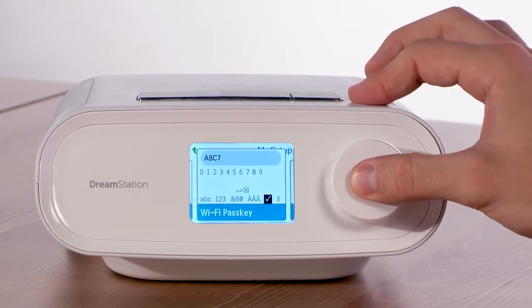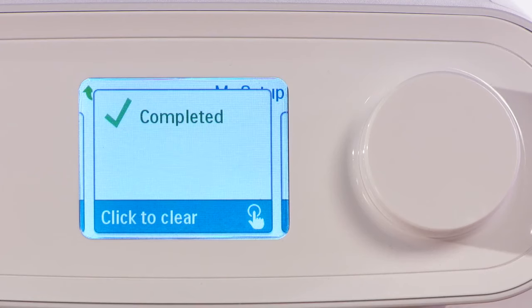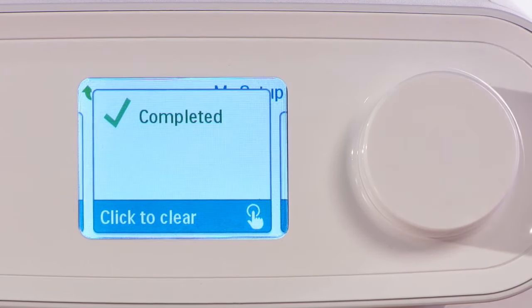After you have entered your password, scroll to the check mark and press the control dial to input the password. A message screen will let you know when your WiFi connection is complete.